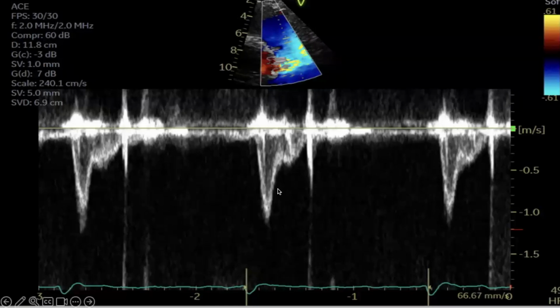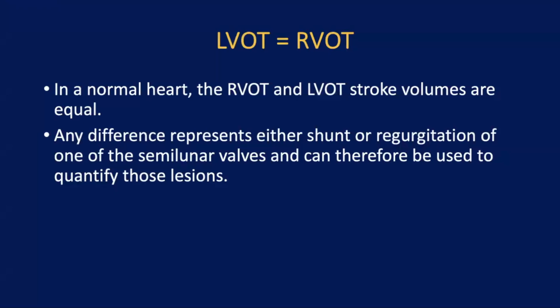You can tell that there is, first of all, a very crisp, very nice modal velocity, sharp acceleration, systolic notch, and the image was zoomed and taken in place. Whoever took it, took her time to do it.